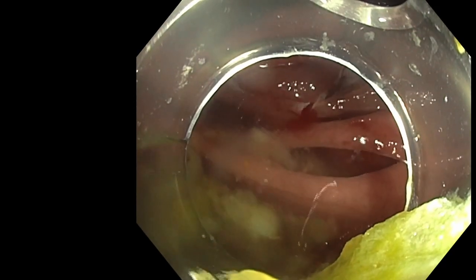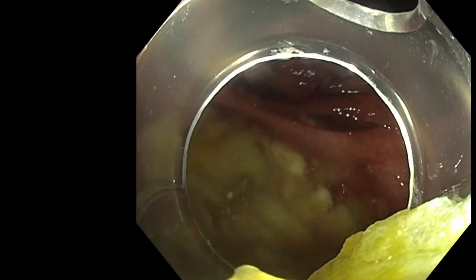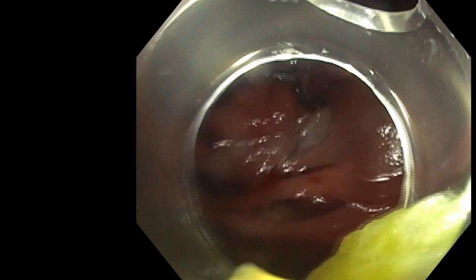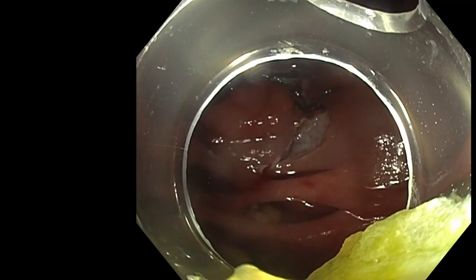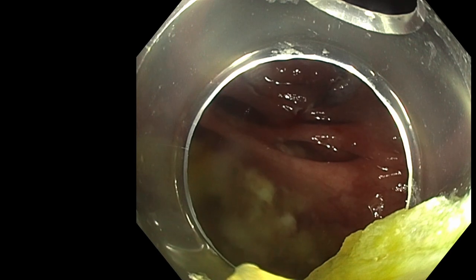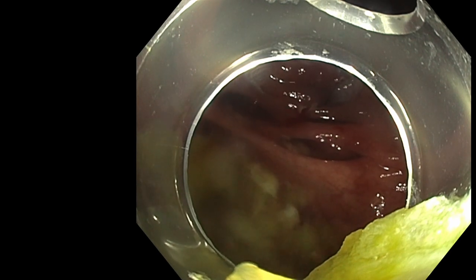And you will see it will change the game a little, because it was not so easy to go under the lesion until now, but once the device comes, it will be easier. It was quite difficult to insert the device. Usually it goes smoothly, but probably there was some residue in the channel because the bowel prep was not very good.